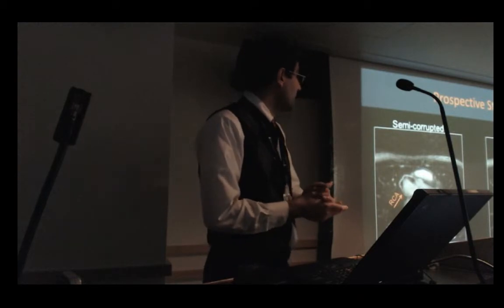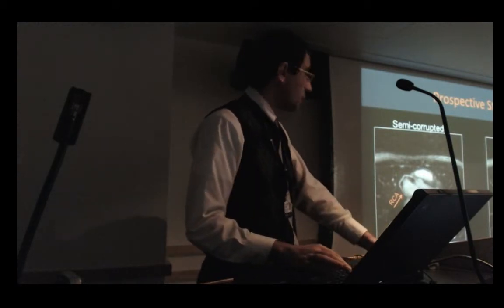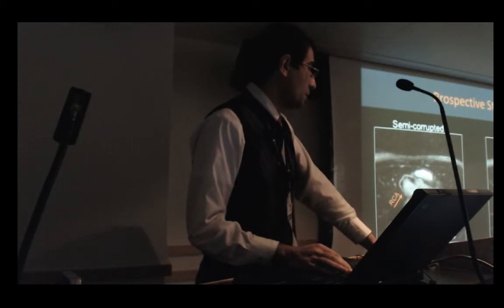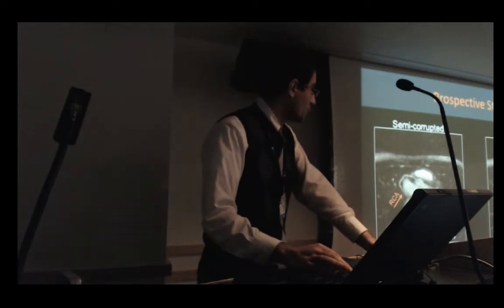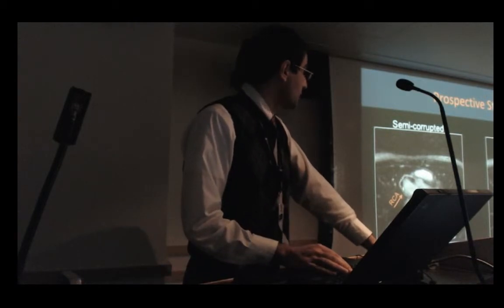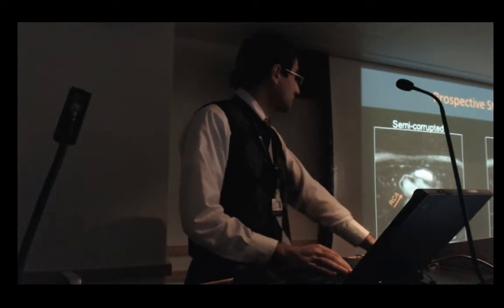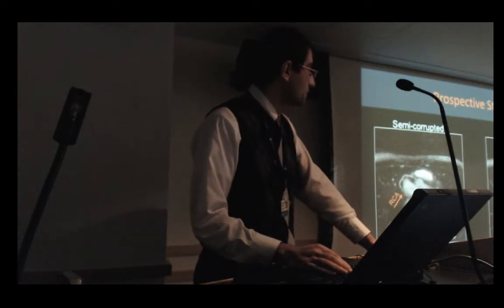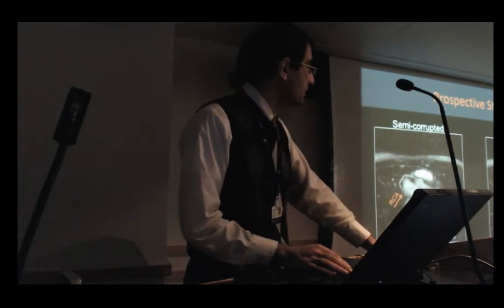We also asked 2 cardiologists to read our images in a blinded fashion and score them. For the visual scoring, we didn't see any statistical difference between the compressed sensing images and the retrospectively gated images. That was a promising result, and we went forward to perform a prospective study.